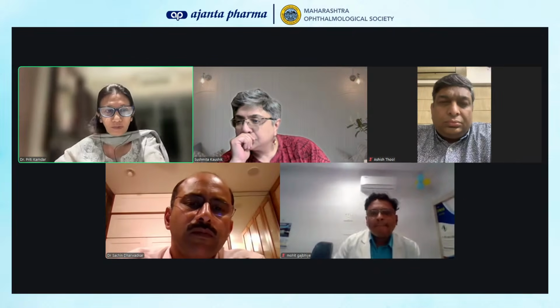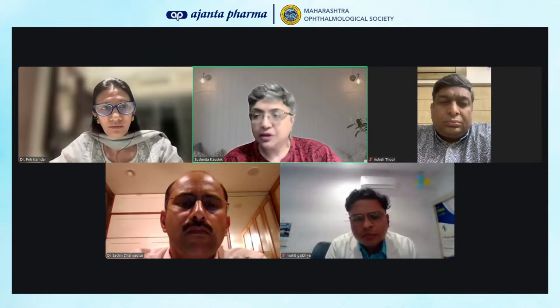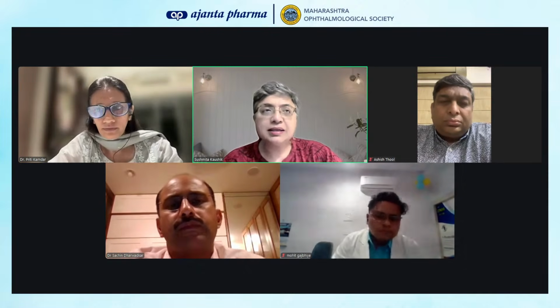So Dr. Sushmita, Dr. Sachin, Dr. Ashish. First and foremost, I would look at signal strength because that is the most variable thing. And the second thing is sometimes even with a good signal strength, even mild increases in a cataract would give you fallacious results, especially if it's posterior subcapsular or something. Then it might go through and the machine might say it is a signal strength of whatever. So I would be very, very cautious in assessing progression on OCT.